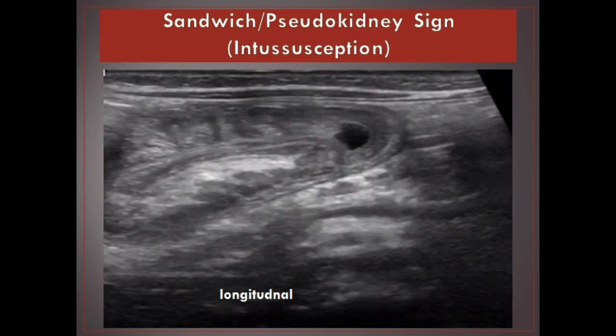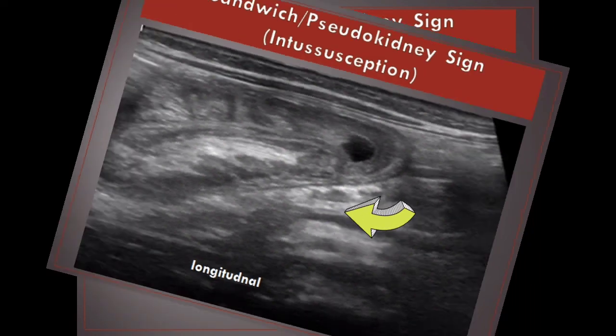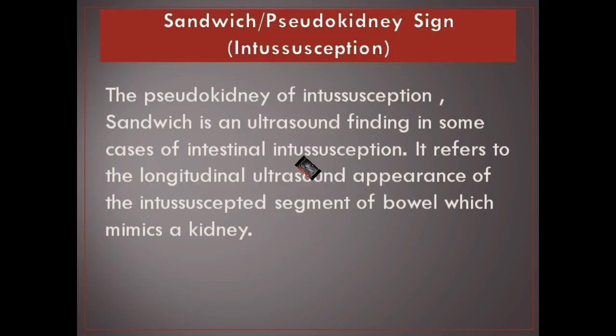Sandwich / Pseudokidney sign. It is an ultrasound finding in some cases of intestinal intussusception. It refers to the longitudinal ultrasound appearance of the intussuscepted segment of bowel, which mimics a kidney.